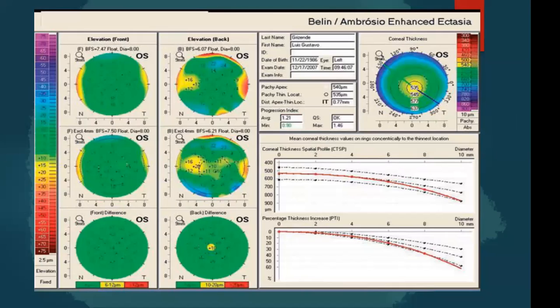It's a more accurate method rather than Placido, because it does not have any reference axis by which it measures the curvature at any point. It does not miss any point in the center of the cornea, which a Placido based image would miss, because there is no ring in the central 3 mm with a Placido based topographer. So a Scheimpflug image is way better and gives us much more detail than a Placido based image.